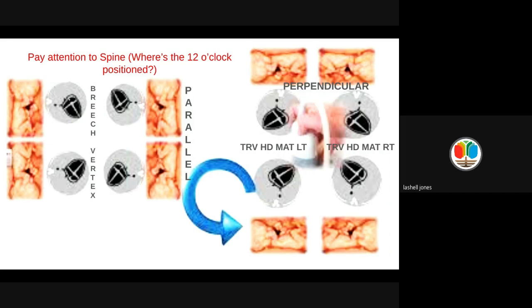For our exam, as I mentioned before, they're going to show you pictures of just the heart apex location and the stomach location. And they're going to ask whether the baby's in a longitudinal lie versus a transverse or perpendicular lie. So it's important in that case to know the position of the spine. That's what's going to tell you the difference.